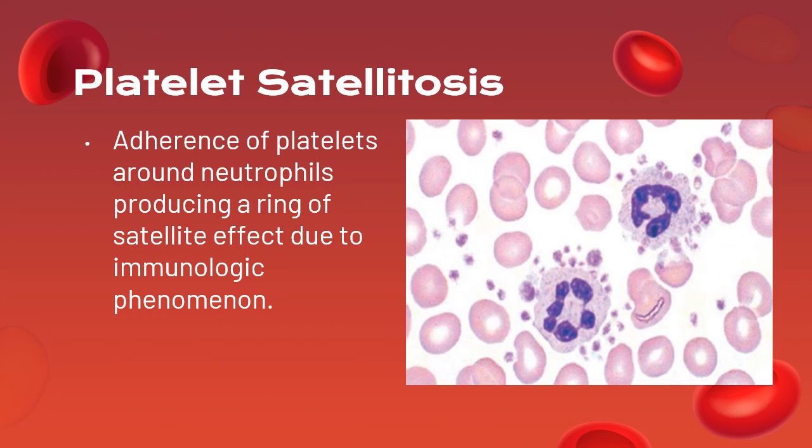Platelet satelitosis also happens in some people kapag sa EDTA tube mo siya kinolect. Okay? So their cells have certain reactions with the anticoagulant na EDTA. Okay? So one thing we can do is diba, kunyari, nira natin siya sa machine, nakita natin mababa. So, ang gagawin nyo is, isi-smear mo siya. Pag smear mo, you've seen platelet, nakakita ka ng platelet satelitosis.